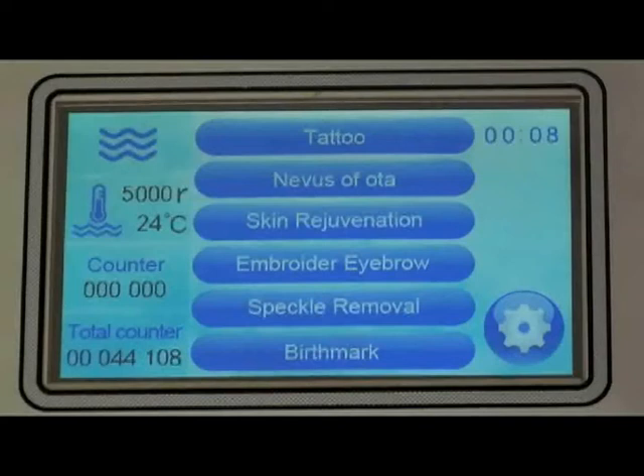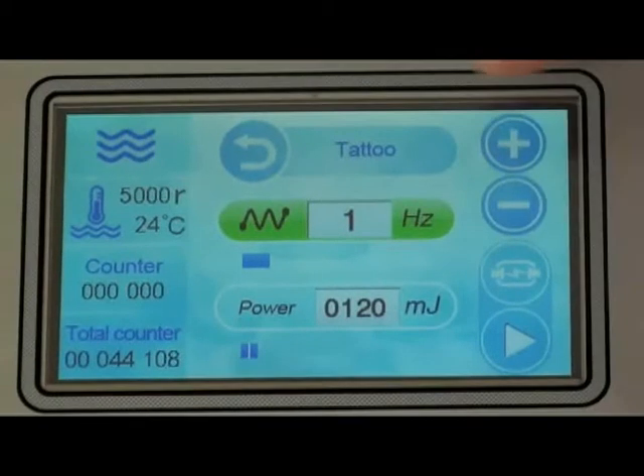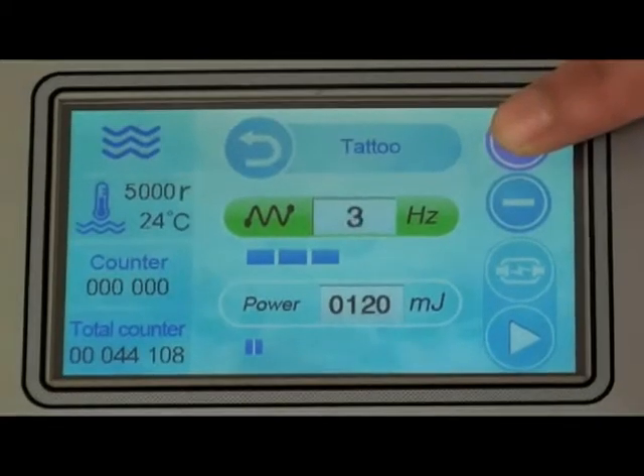Adjustment of the screen display: therapy programs on the operation screen include tattoo, nevus, carbon skin rejuvenation, embroider eyebrow, speckle removal, and birthmark. Select any treatment item on the operation screen. Choose Hz and press plus or minus to adjust frequency — frequency means the flashes per second, adjustable from 1 to 6.